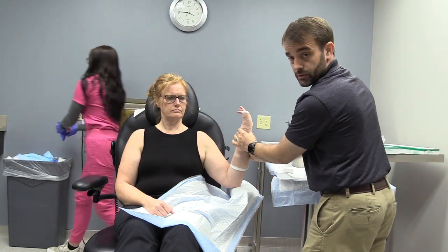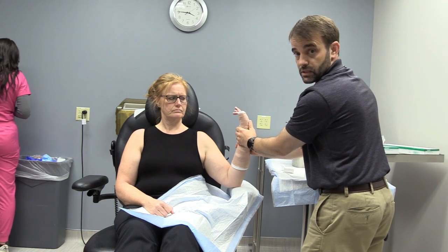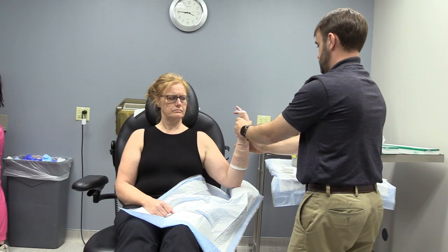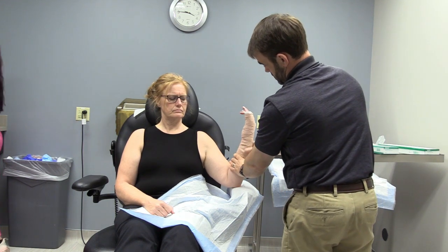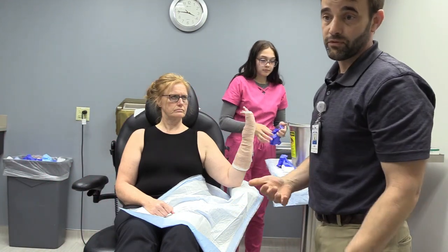If it was a metacarpal base fracture, that might actually cause them pain, so then I would just give them a little bit of flexion of the wrist to offload some pressure. And there's that. Just set them on a pillow and then allow them to dry before you let them leave.